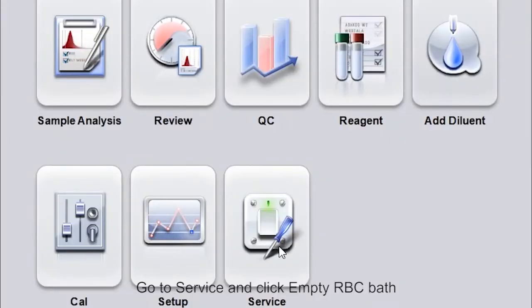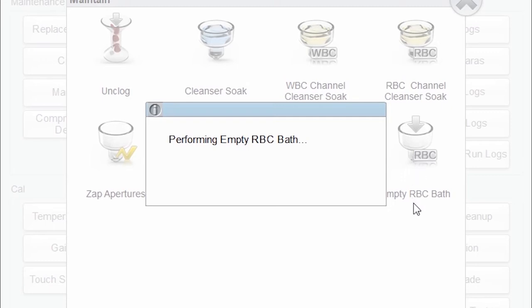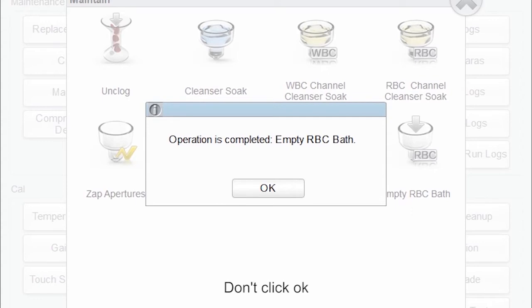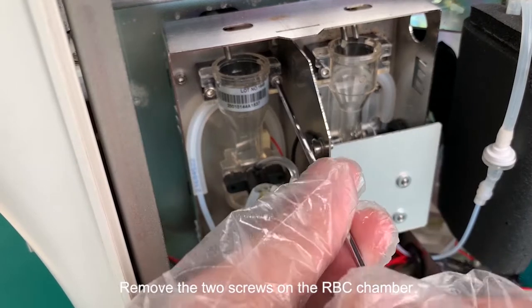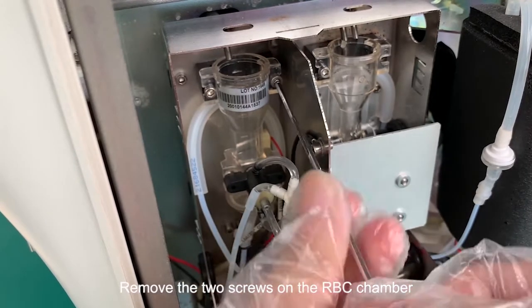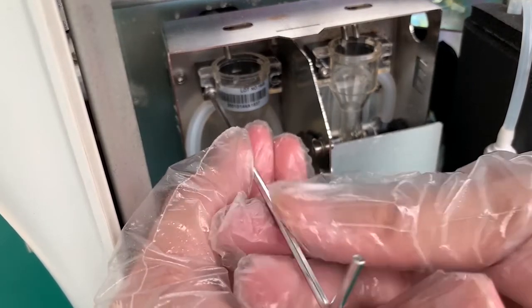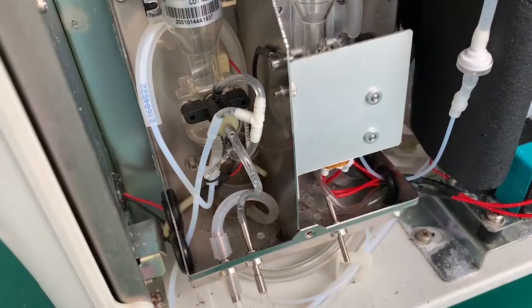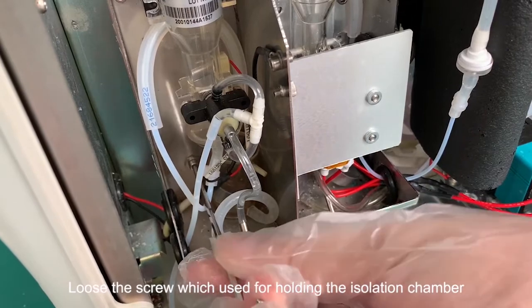Go to Service and click empty RBC bath. Don't click OK. Remove the two screws on the RBC chamber. Loosen the screw which is used for holding the isolation chamber.